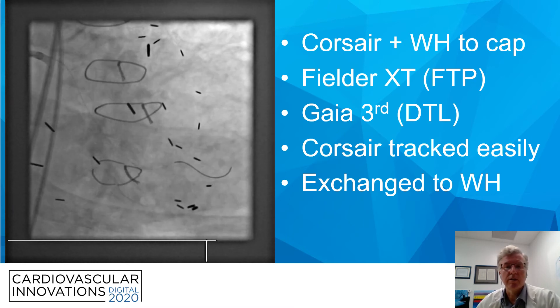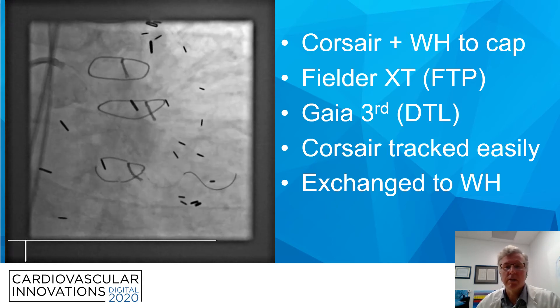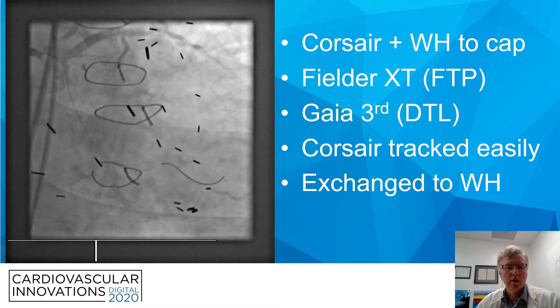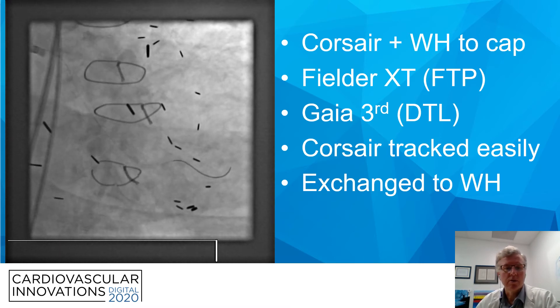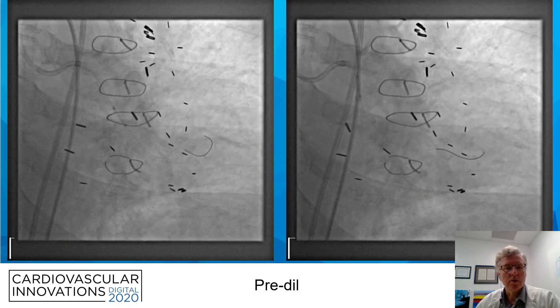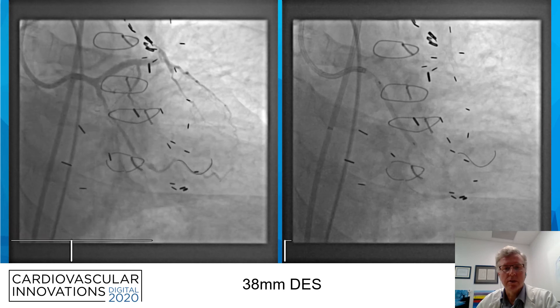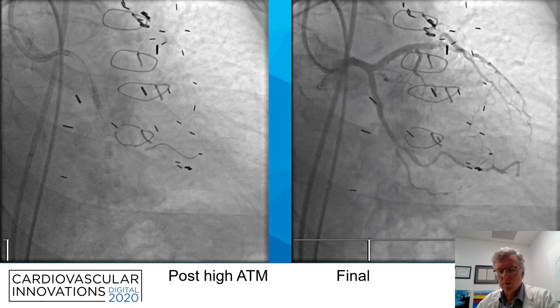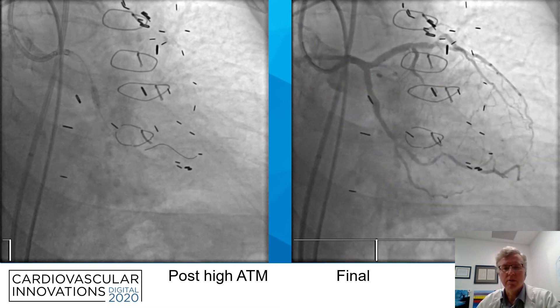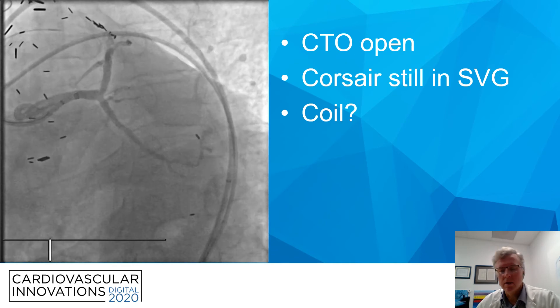In rather short order, we were able to advance a workhorse wire to the cap, switched to a Fielder XT — which did not penetrate the cap — then swapped up to a Gaia III, which navigated through and attained distal true lumen. The Corsair tracked easily down to that position and we exchanged. Once the workhorse was in, we did some pre-dilation. We then positioned and deployed a 38-millimeter long drug-eluting stent, performed high-pressure post-dilatation in multiple locations up to 22 atmospheres, and you see the final result once the wire is removed — the CTO is open. You can see that we still have the Corsair in the vein graft.